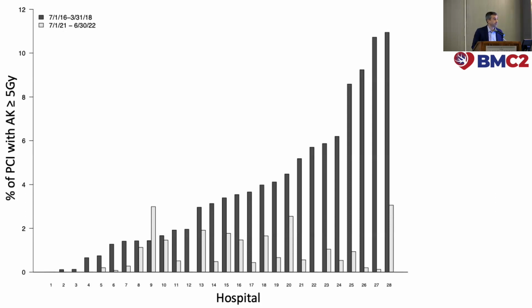It was all about staging the procedure, changing the technique, or double scrubbing to help expedite the process. We noticed some change in pattern, especially with the beginning of the year compared to the end of the year, at the level of the training of the interventional fellows. So we ask them to scrub from the beginning of the case, because sometimes they struggle to engage and take a whole lot of radiation before the attending engages and proceeds with the procedure. It ends up being complex. So these two things, awareness letters and reviewing cases, helped us go significantly down.